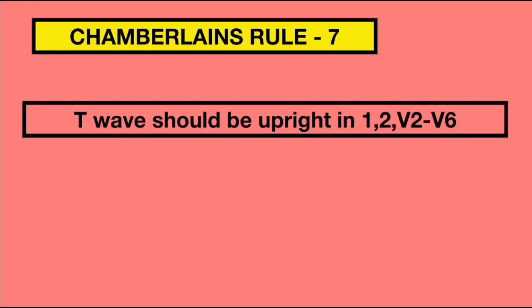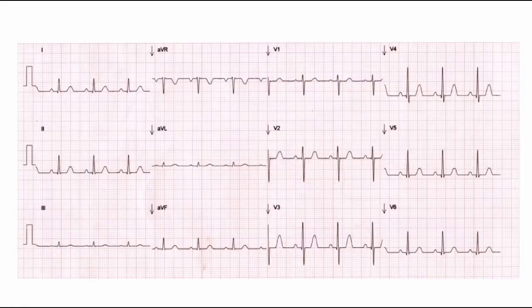Rule 7 states that T waves should be upright in leads 1, 2, and V2 to V6. We can see that in lead 1, lead 2, and leads V2 to V6, T waves are upright.